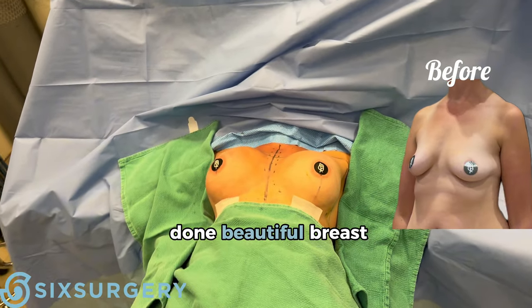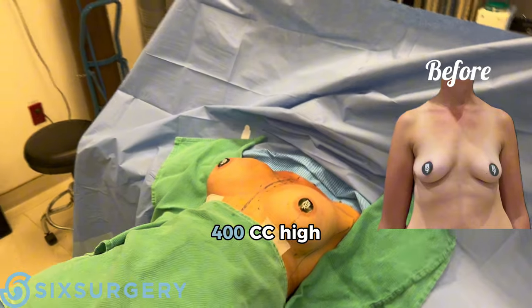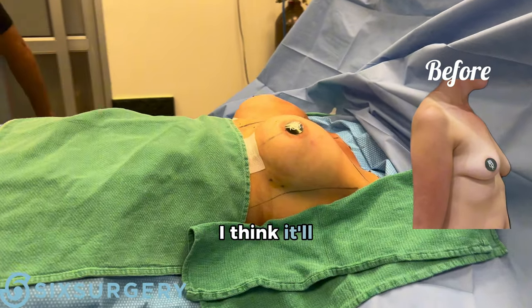And we're all done. Beautiful breast augmentation, 400 cc high profile. I think it'll be beautiful.